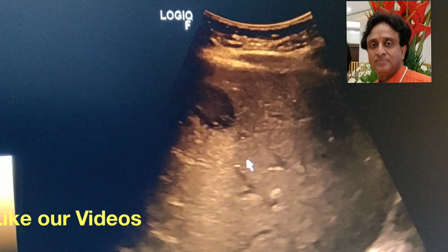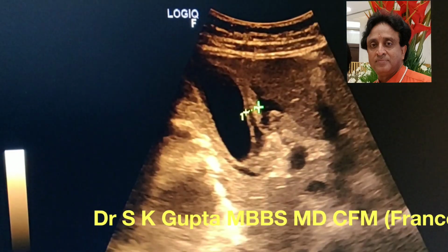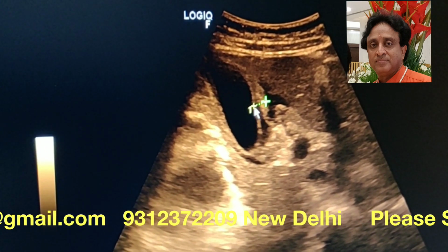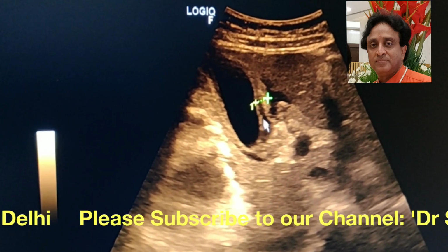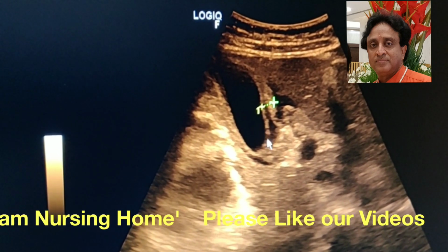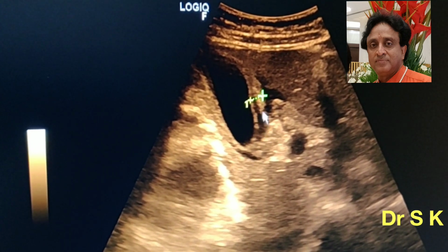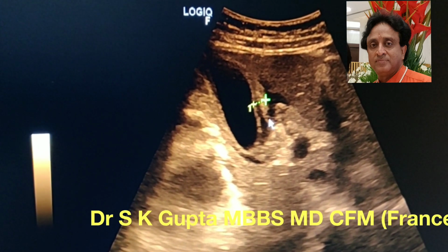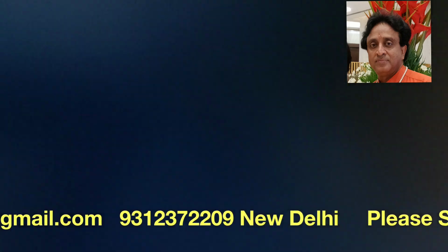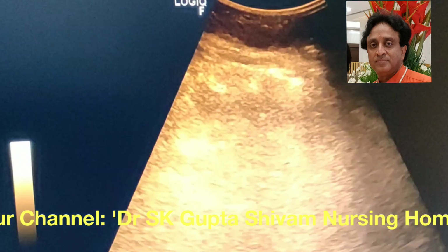Here you can see there is fluid around the gallbladder fossa, and the gallbladder wall thickness is increased. It is 7.83 millimeters. Normally the gallbladder wall thickness is less than 3 millimeters, but here the muscular layer of the gallbladder is increased in size and thickness. And you see that inside the gallbladder, the inner mucosal layer is absolutely smooth. It is the muscular layer which is edematous, and around the gallbladder you see that there is free fluid over here. And this is a case of polyserositis, or ascites, at least to say that it is a case of ascites.